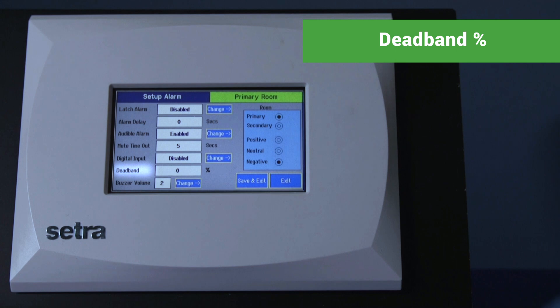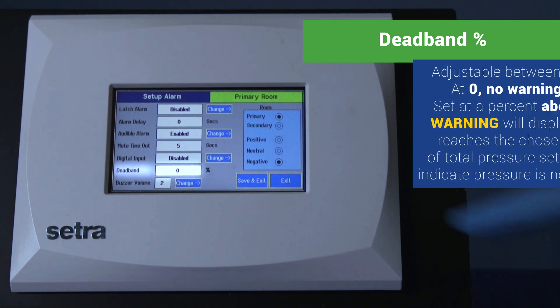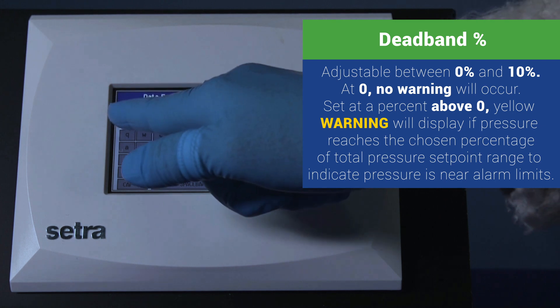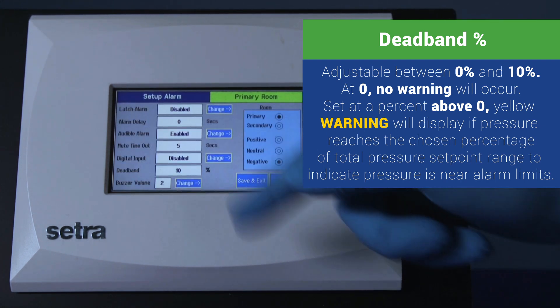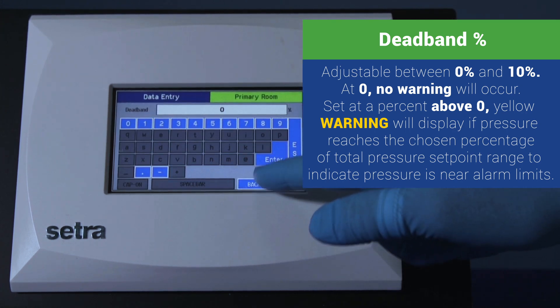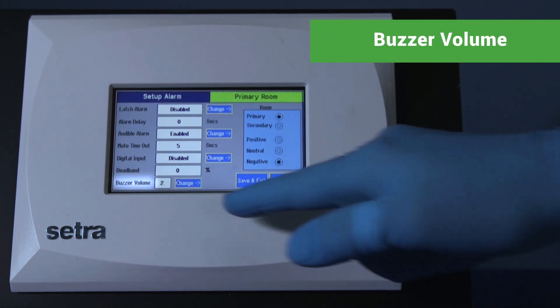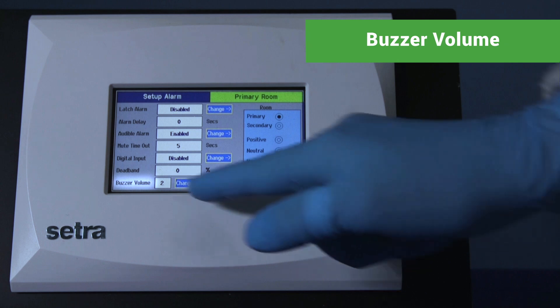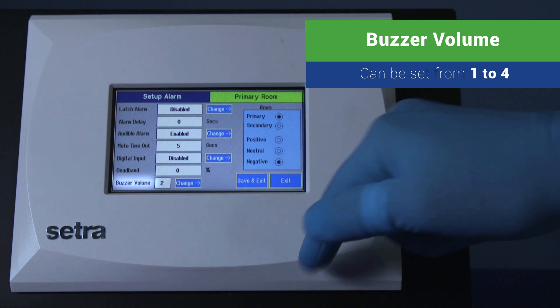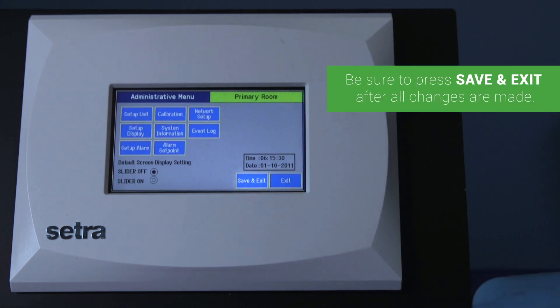Dead band percentage: adjustable between zero — no warning will occur — and ten percent. A yellow warning will be displayed if the pressure value reaches that percentage of total pressure setpoint range, to indicate that the pressure is near alarm limits. Buzzer volume: set from one to four, where four is the loudest. Be sure to press save and exit after all changes are made.